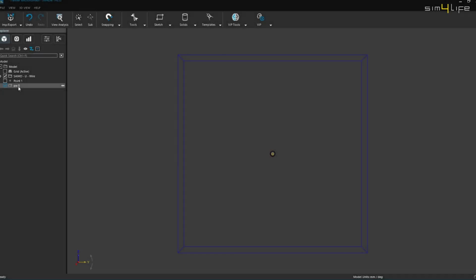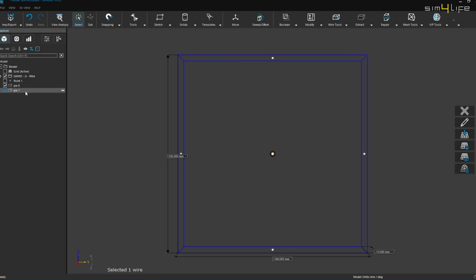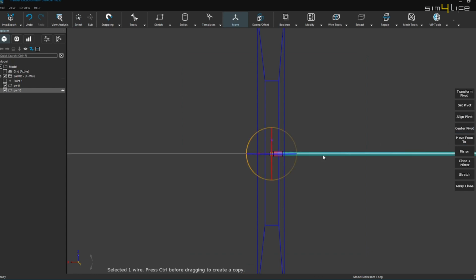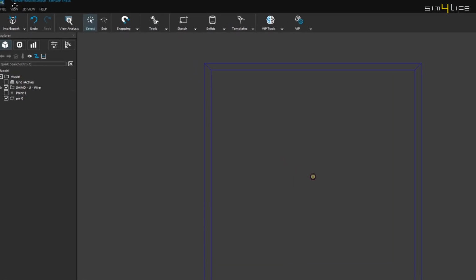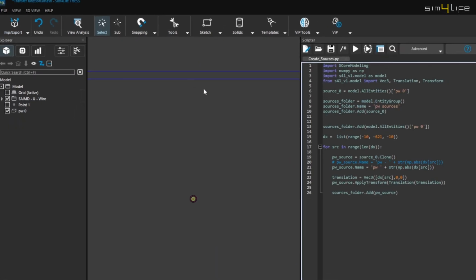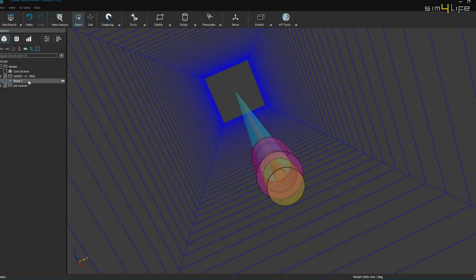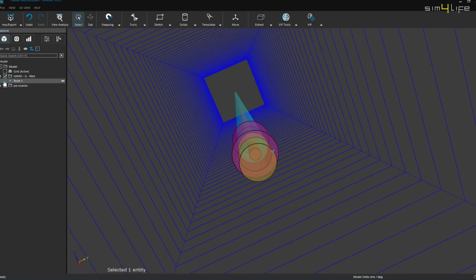We continue by creating a wire block that will serve as our first plane wave source at the implant's tip. We then proceed to add consecutive plane wave sources along the length of the lead, with each one exciting a 10 mm section. To achieve this, we have two options. We can either manually clone and move the plane wave source by 10 mm each time, or we can use Python scripting in Sim4Life to speed up the process and minimize manual adjustments. The resulting electric field will be recorded at point 1 near the tip.